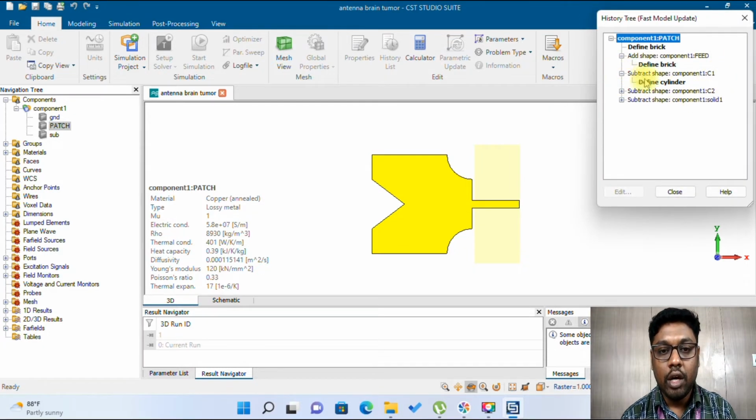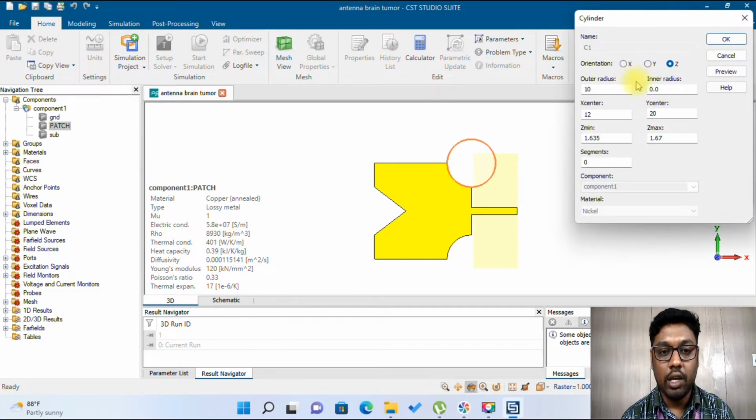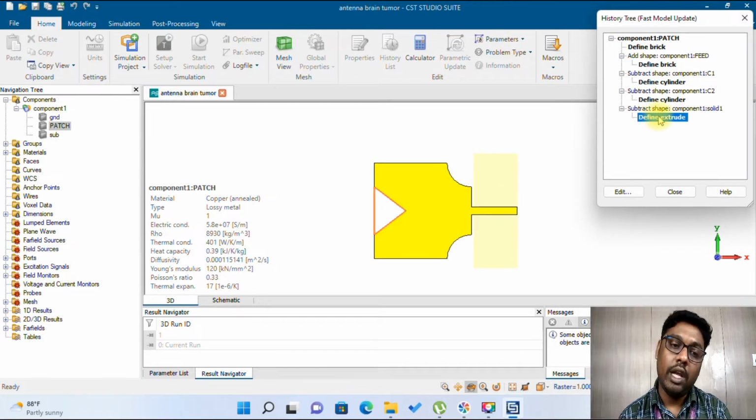Later I created a circular cylinder, keeping the inner radius as 0 and the outer radius as 10, and I cut the corner portion of this microstrip. I have done this for both the bottom corners, so typically the shape will look like this. Finally I did another cut using the extrude option in CST.